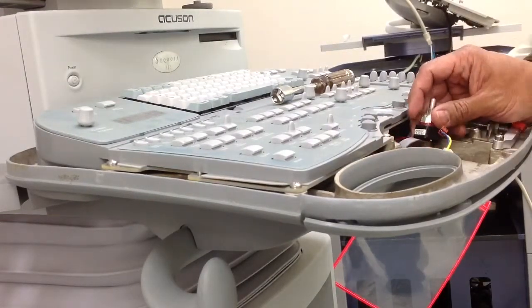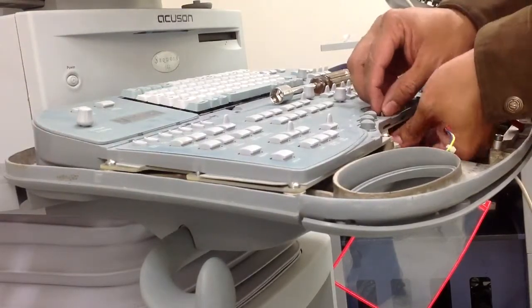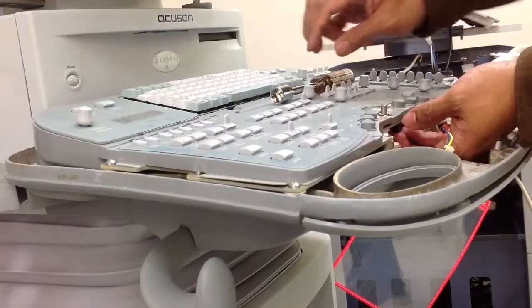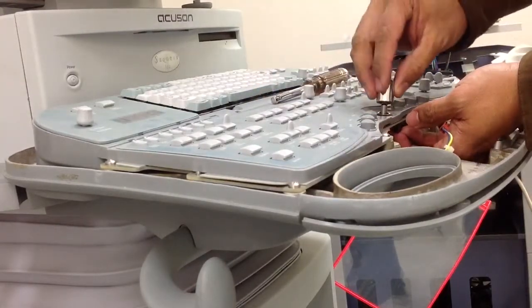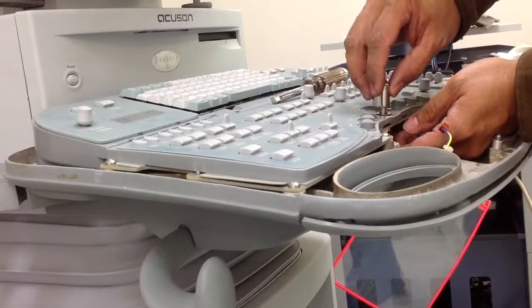You will hear the click. When you hear the click, that means it's already locked or connected. Then use your hex wrench to tighten up the nut.